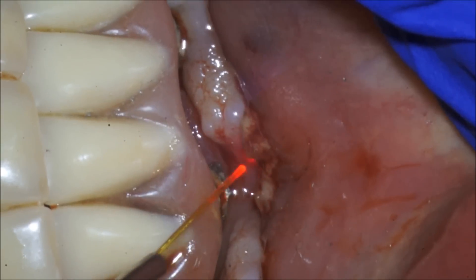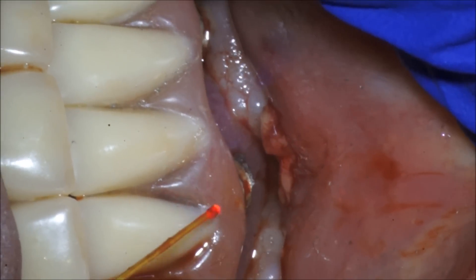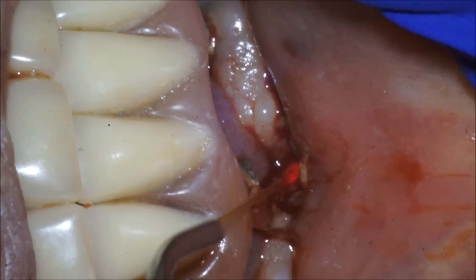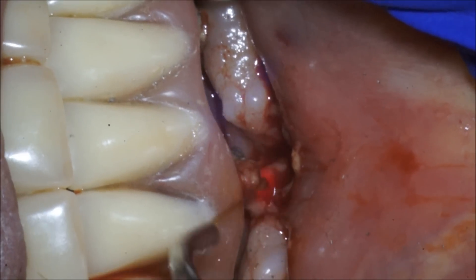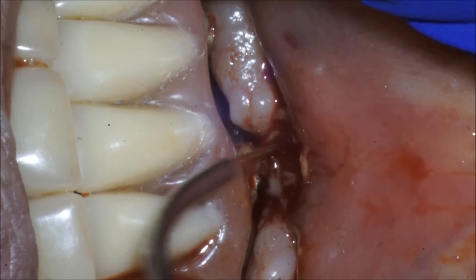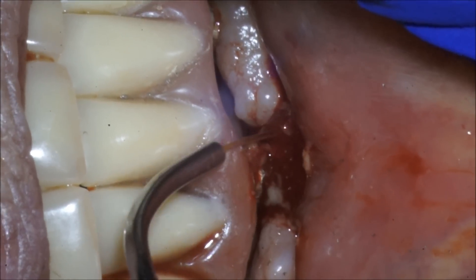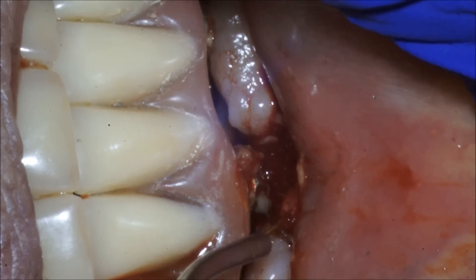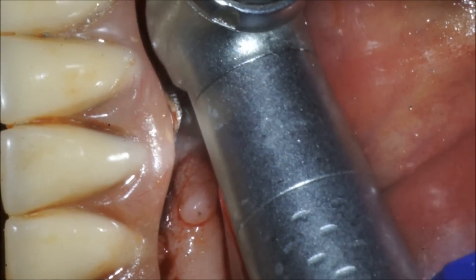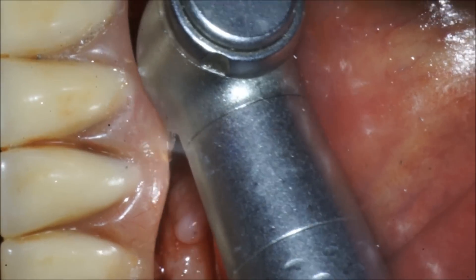This may be a Zimmer implant — I'm going to send this to the lab. It might be a Screw-Vent. Here's the Nd:YAG laser we're using to disinfect the site. The Nd:YAG is a very good laser for disinfection. We're using a setting of about 250 microseconds at about 4.6 watts, just stirring up and cleaning out that infected area.